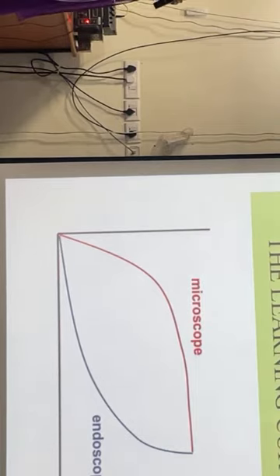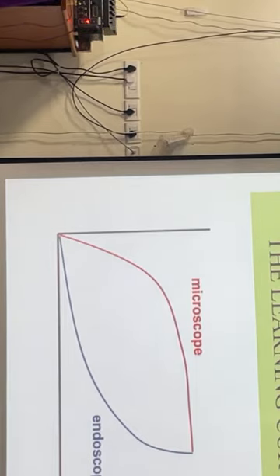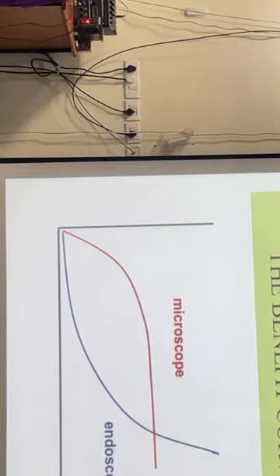So now I think whenever a new thing comes up, the learning curve is slow in the beginning. It is slow in the beginning, but once we achieve that level, it will go rapidly upwards, whereas in a microscope, we get that stagnation. There are otologic surgeons who are using the endoscope as easily as a microscope. So the benefit curve goes straight up once we overcome the initial inertia.